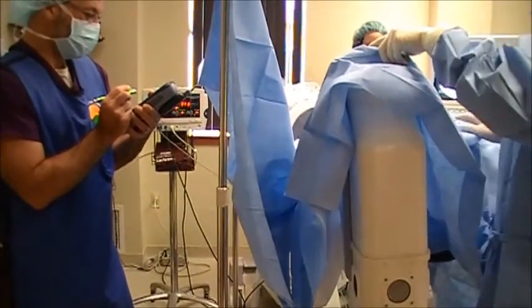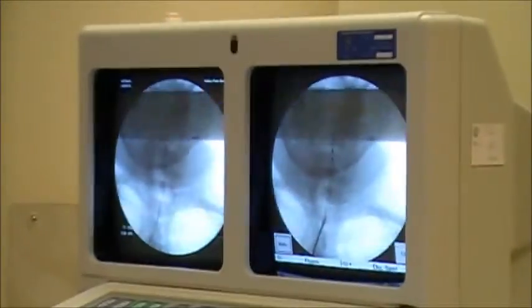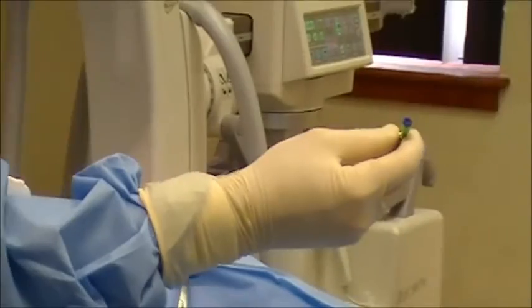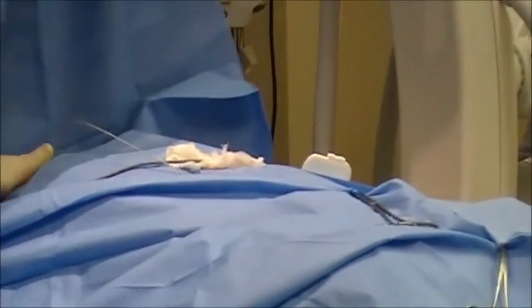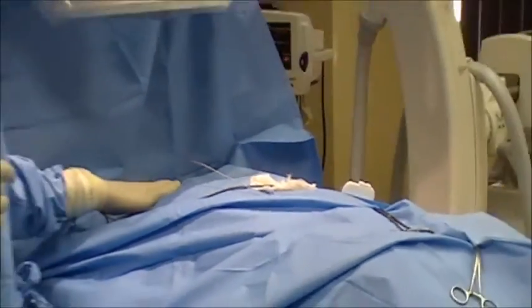To ensure the lead has not moved at all, if you compare the fluoroscopic image on the left to the image on the right, they are pretty much identical. We then carefully remove the stylet from the electrode as well as the needle, securing the lead in position, and send the patient home for approximately three days to do an at-home patient trial.